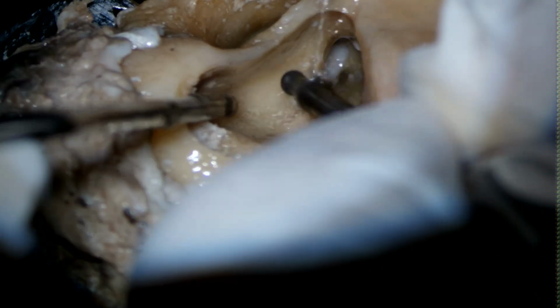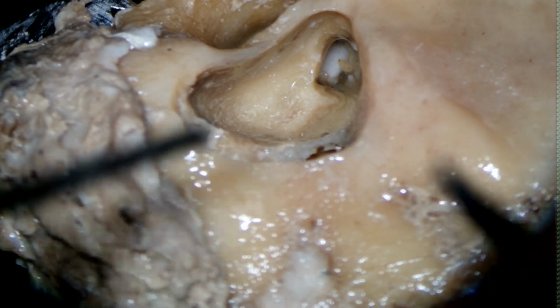So basically, I am trying to find the facial recess.